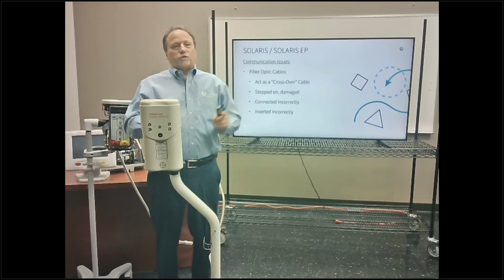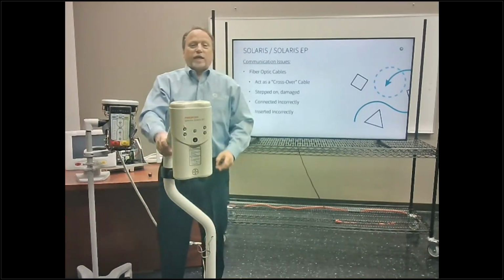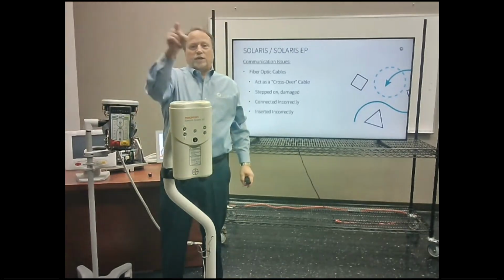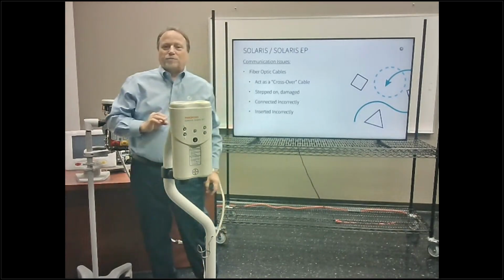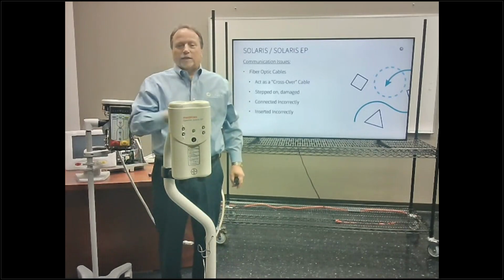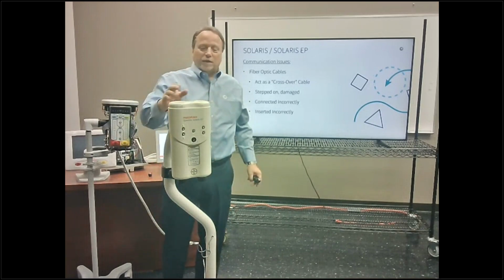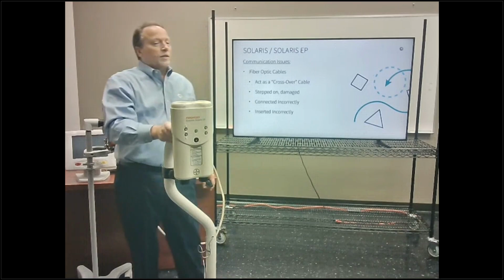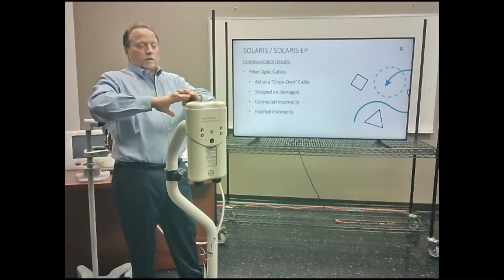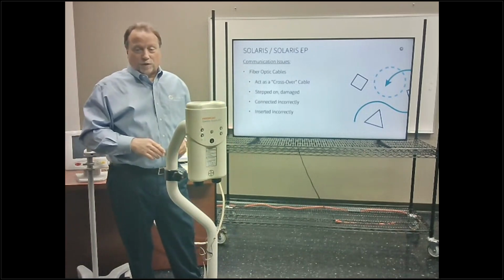Now, if you're old enough to remember a crossover cable, if we're talking computer to computer, you know that cable crosses over. Transmit to receive, receive to transmit. That's how the fiber optic cables are supposed to be connected. Not R to R, T to T. R to T, R to T. Crossover. I've seen that many times on tech support calls, that the cleaning crew comes in, or the CT crew, or the MRI crew has changed stuff around, and they disconnect and connect those fiber optic cables.